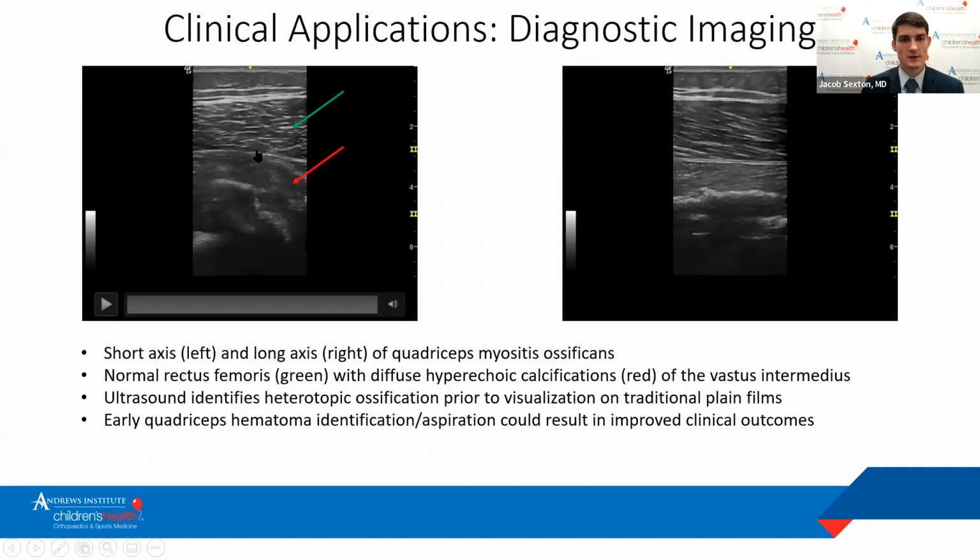And then as you can see, once you go past this fascial plane, you lose that nice starry night sky pattern. It becomes very gray, very isoechoic, which lets me know there's significant soft tissue edema within this muscle tissue because it's lost that normal anatomical structure on ultrasound.